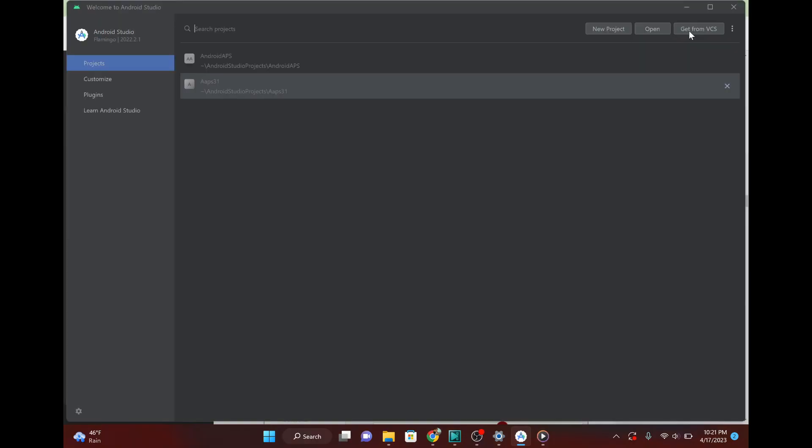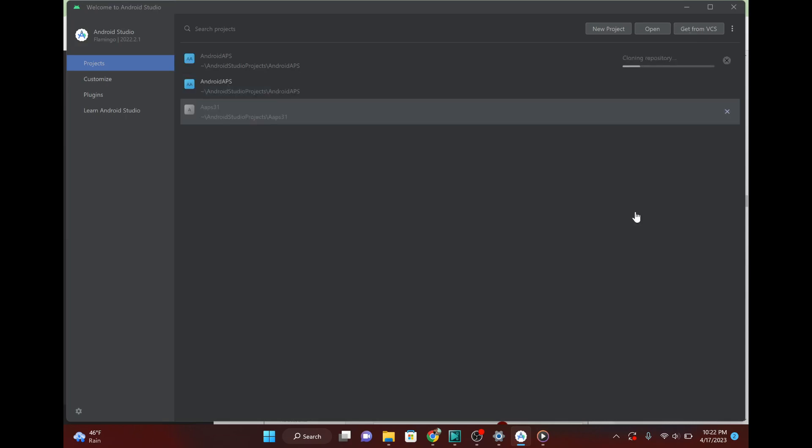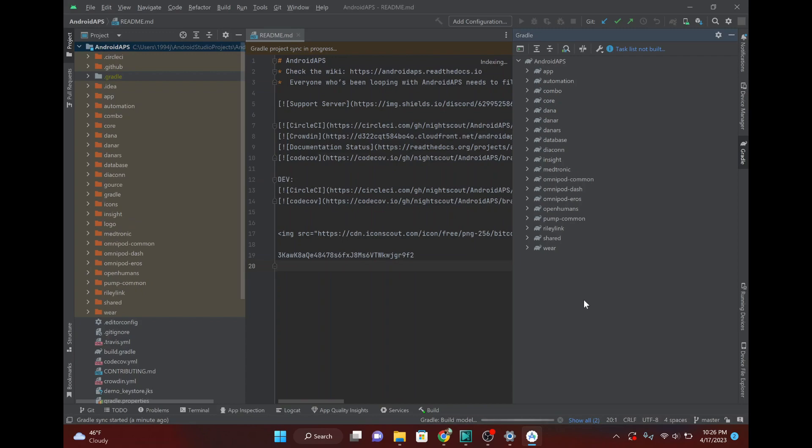And that will take a minute as well. And we'll let that run and check back in once it's done. But basically what you're doing, so Git basically lets you just get the code from GitHub which is where all that code is stored and you're basically just copying.